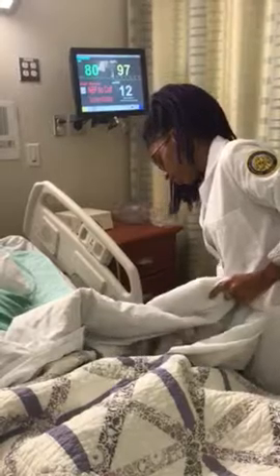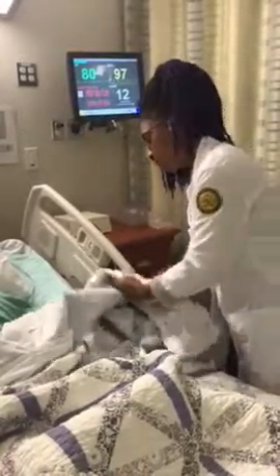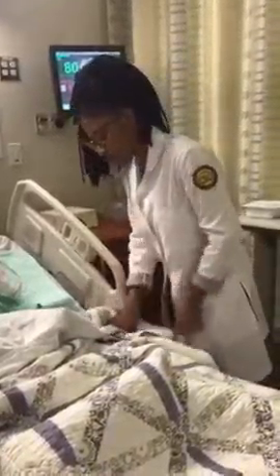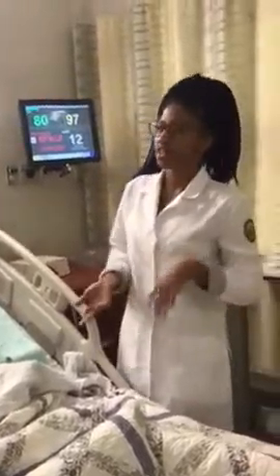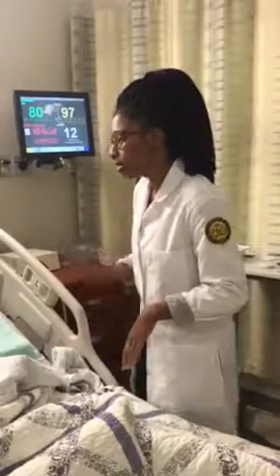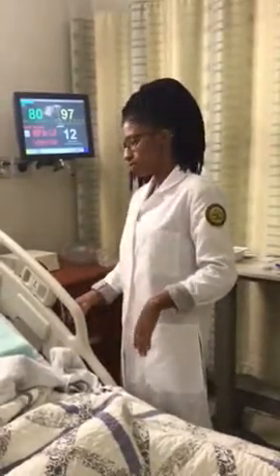And I'm just going to check it with the patient's ID. Thank you very much. And are you having any pain today? Okay. I have given the patient pain medicine 30 minutes prior. They have stated that they're not feeling any pain on a 0 to 10 scale. And now I'm just going to elevate the bed.